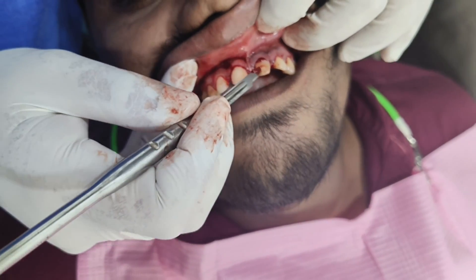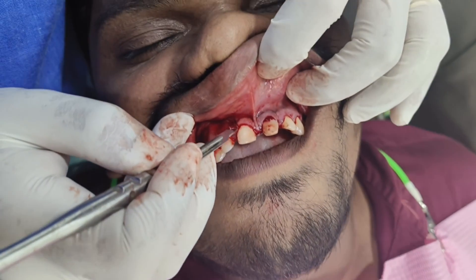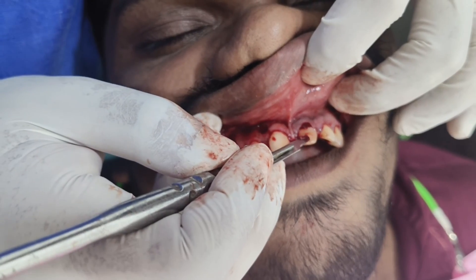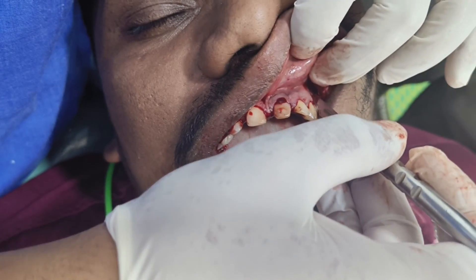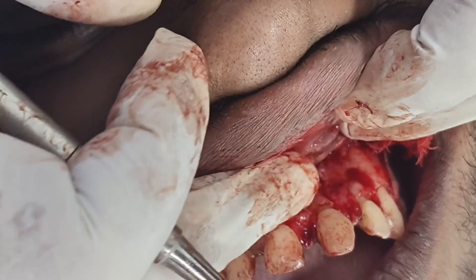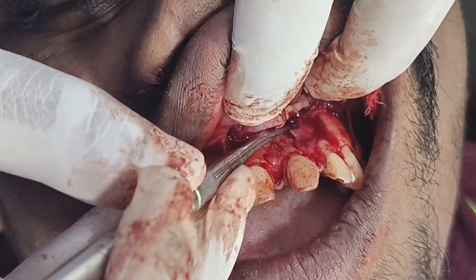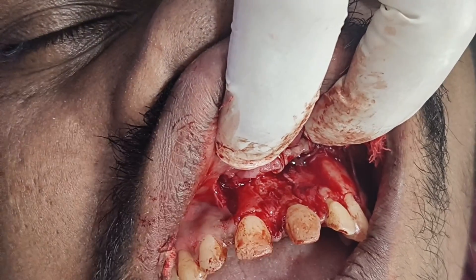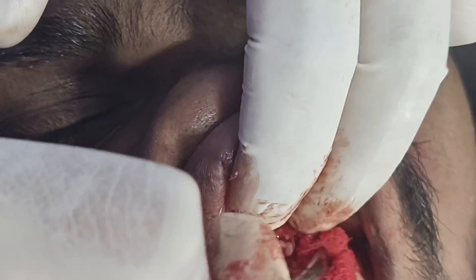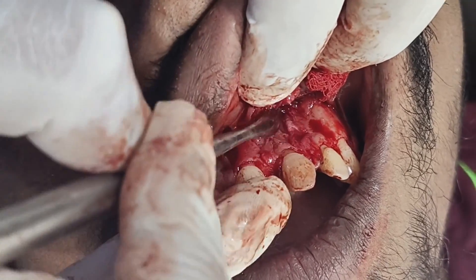We are going to remove the cyst in relation to teeth 21 and 22. We are going to take out the flap from 11, 21, 22, and 23. This is in relation to 21 and 22, and now we have raised the flap. We are going to drill the bone in this region and take it out from this particular area.